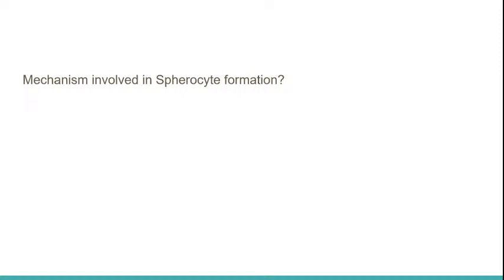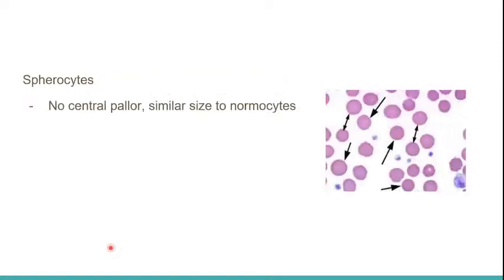And when there's more sodium, the basic notion is that wherever sodium goes, water follows. And when there's increased water, these cells balloon up and they lose the biconcavity structure and they become spheres or globes. Abnormality in sodium influx is the answer to that question.